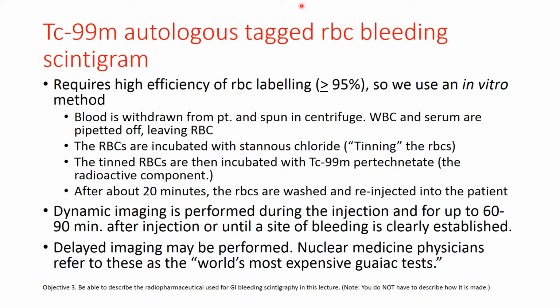So this is a good study for detection of lower GI bleeding. And what we do is there's a process involved in this. We use what's called an in vitro method. And the reason we do that, it's the more complicated way to tag red blood cells.